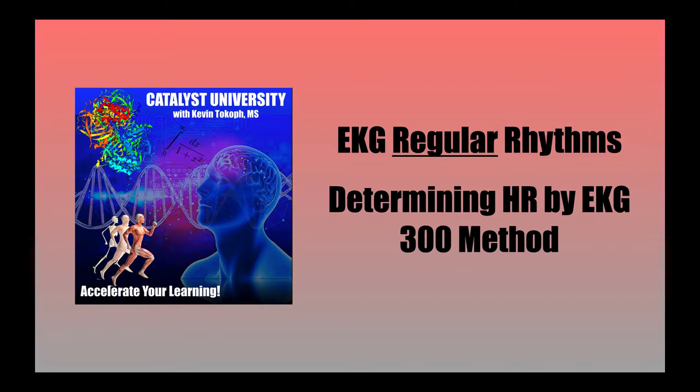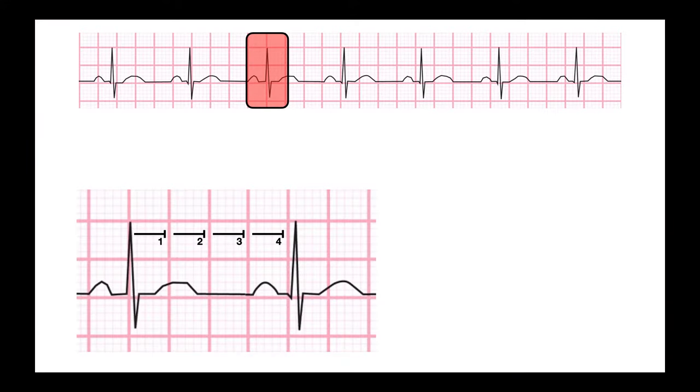The other method we can use on regular rhythms is the 300 method. This is a method that does not require a calculator. It's less accurate and it seems to be the method preferred by a lot of instructors. So let's go over how to do this. First I determine if this EKG pattern is regular or irregular. This is the same pattern from before so it is regular. Then we need to determine which peak is best to use. Again we're going to look at the peak that's right on this solid line.